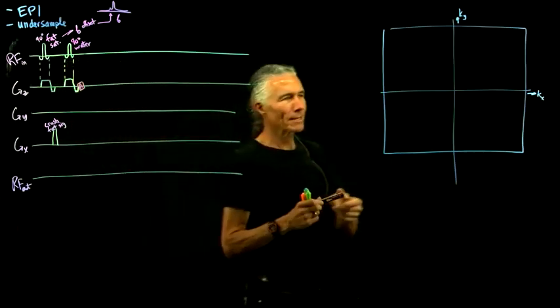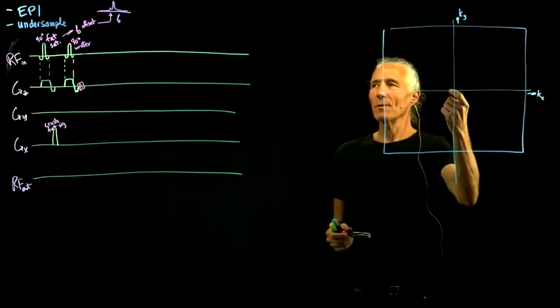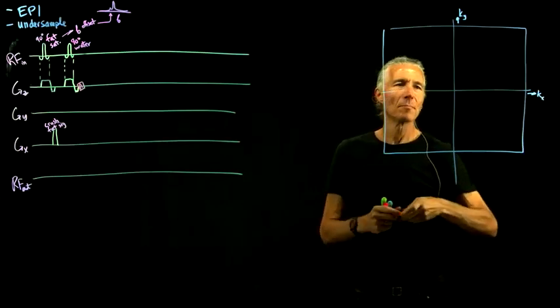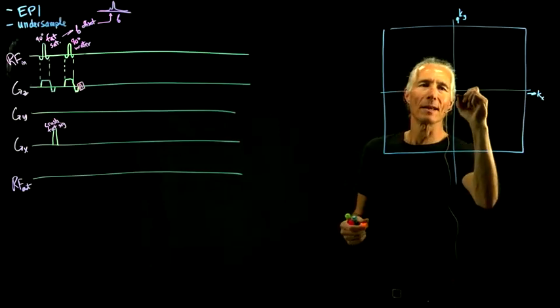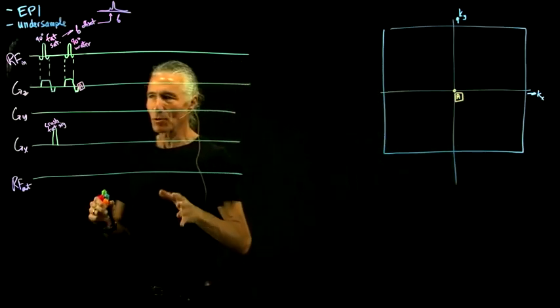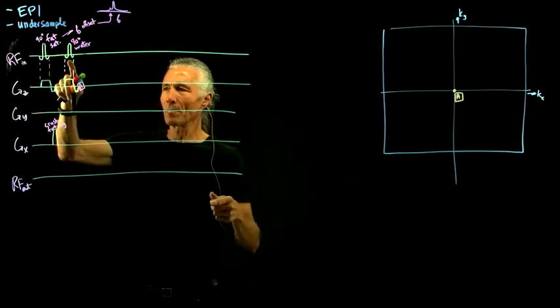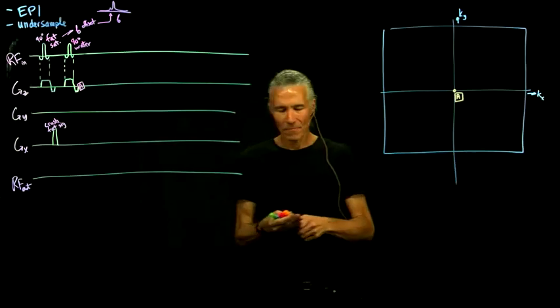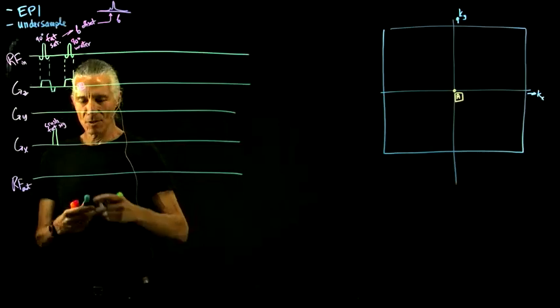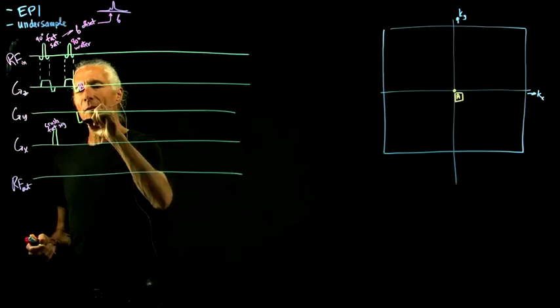When we do our slice select, we come out of the board, and then we do the slice select fixer. It brings us back into the board, and then that starts us at the middle at point A. So that's point A right there. At the middle of K space, no stripes, all the spin phase lined up because of the 90 RF pulse. Okay, and then even while we're in the midst of doing that, because we want to save time, we go to the far left side of K space and the bottom of K space.